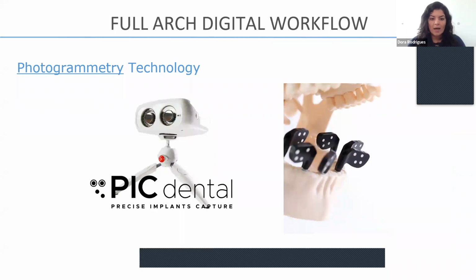And then we have the PIC Dental, and this is the one that I use. This is the one that I love the most because it's really, really easy to use and to output your data once you do the scans. Another cool thing about it is that you can use it for any implant system available, abutment level or implant level.